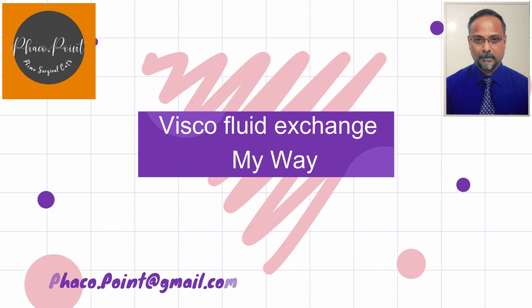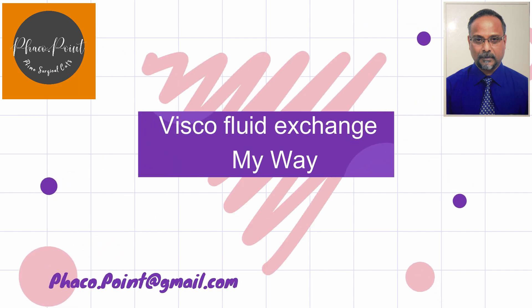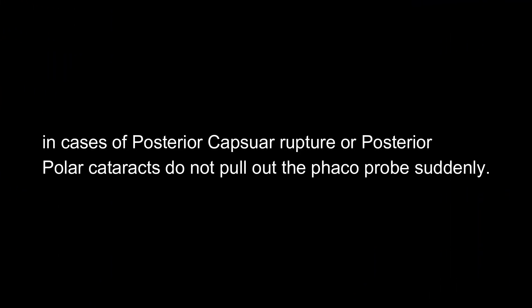During the visco fluid exchange, when you have a posterior capsular rent or in a case of posterior polar cataracts, do not pull out the phaco probe suddenly, because this will lead to an extrusion of the intraocular contents due to sudden decompression. Instead, what we need to do is perform a visco fluid exchange.